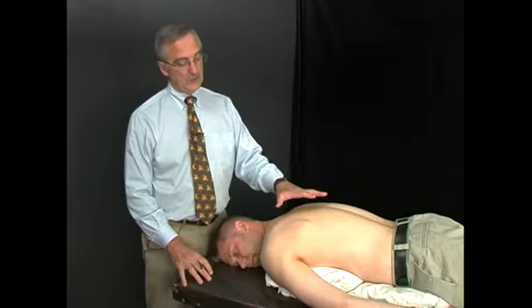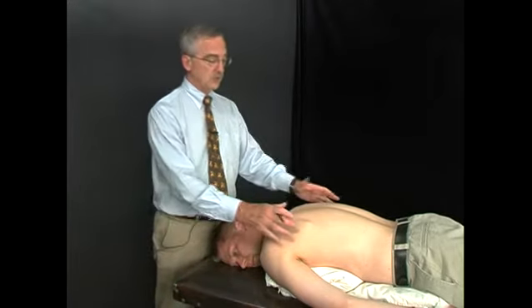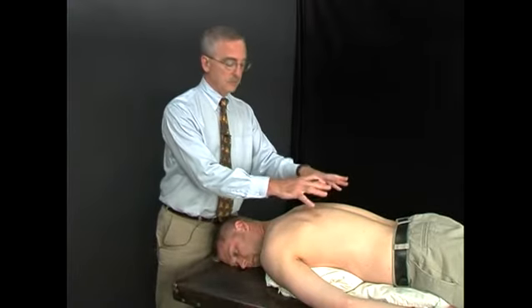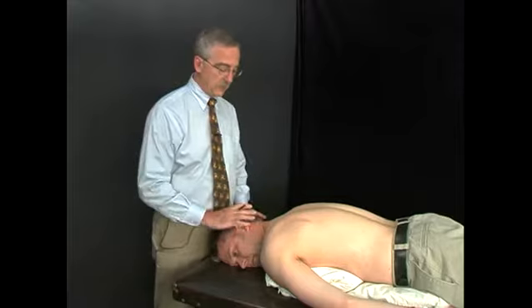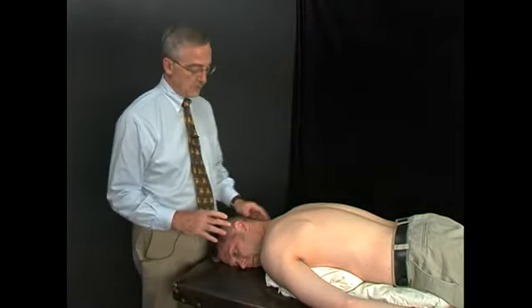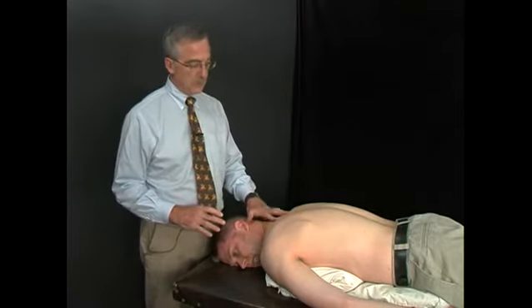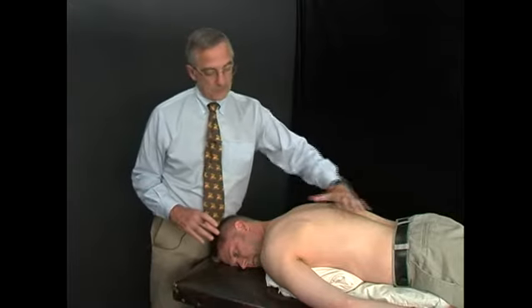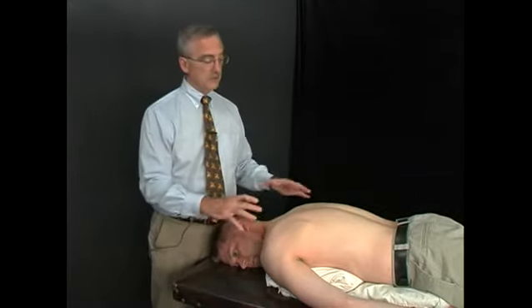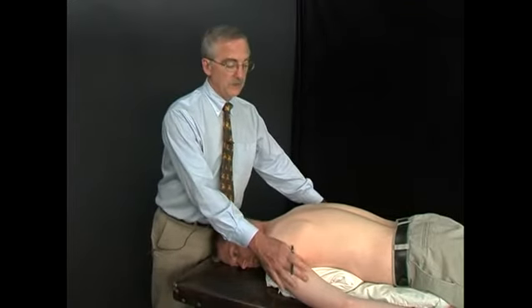When we're injecting the cervical and thoracic spine, we wish to have the patient positioned with a pillow lengthwise down the body. This elevates the ribs, allows the head to be flexed in a position that eliminates much of the cervical lordosis and gives us easier access to the spinous processes in the cervical area. So again, we want the pillow lengthwise down the body, as we have it here, not crosswise, so the patient can be relaxed.